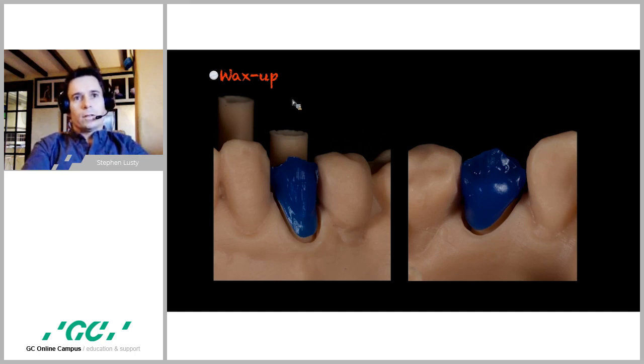I'm sure that all of the lithium disilicate manufacturers are going to, at some point, bring out millable versions of their own ingots, just as we have become used to seeing from Ivoclar Emax. Now, I can't say that I'm a fan of milled ceramics other than zirconia, but for one, the cost of production is high, as when you operate a milling machine, you'll realize that it is not just the blanks that cost, but milled ceramics wear burrs quickly. Wet milling machines cost more money than dry ones and require more maintenance. And chipping of ceramics is a real possibility, especially if you're pushing the boundaries of the materials. For these reasons, I prefer to mill in wax or print the units into resin and press them.